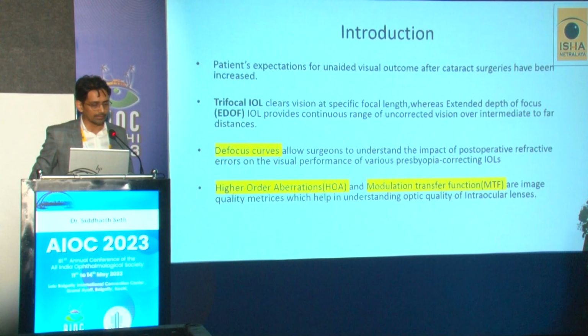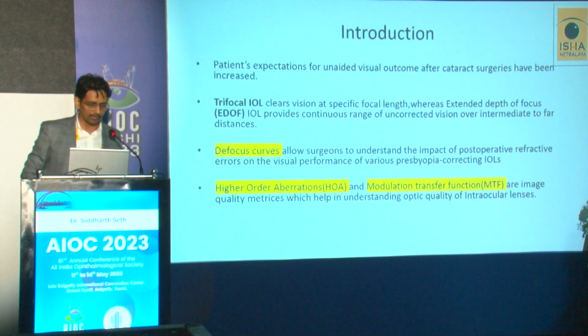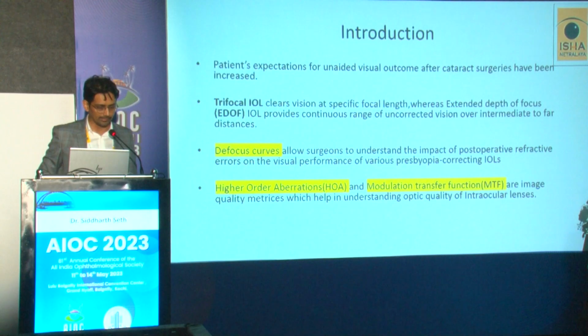Presbyopia correcting IOLs include trifocal and EDOF lenses. Trifocal lenses give clear vision at specific focal lengths, whereas EDOF, that is extended depth of focus IOLs, provide a continuous range of uncorrected vision over intermediate to far distances. There are a few parameters which we can use to analyze the post-operative results.